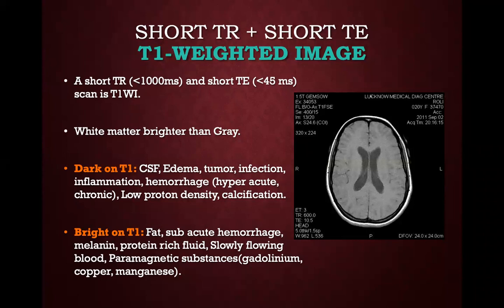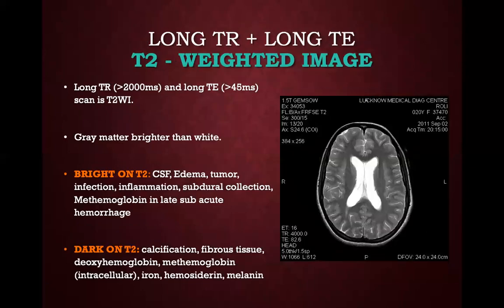What is the clinical significance of it? Can anybody tell me the clinical significance of manganese being bright? Manganese is significant because in hepatic encephalopathy, we look at the basal ganglia.